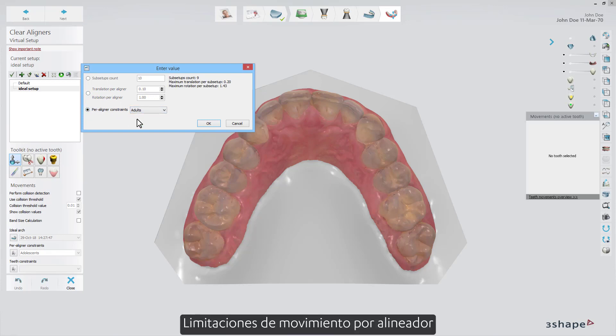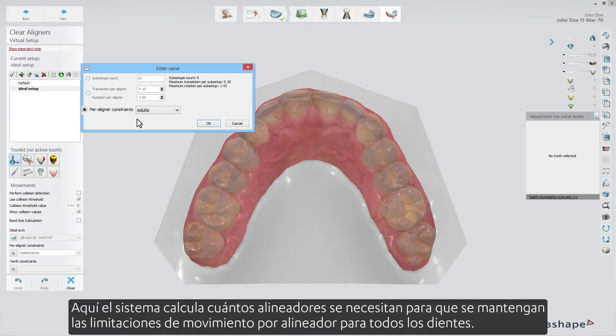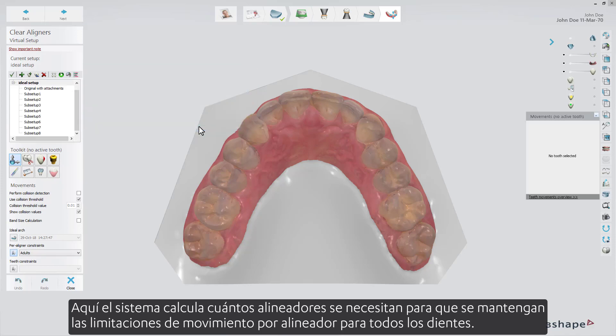The third method is Per-aligner movement constraints. Here the system calculates how many aligners are needed so that the per-aligner movement constraints for all the teeth are being kept.